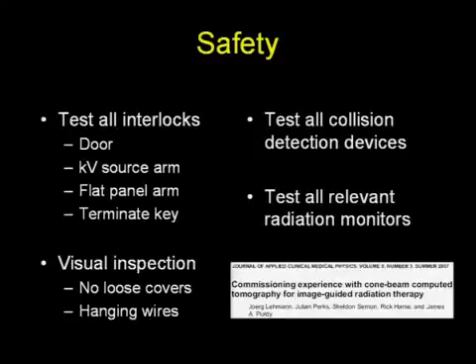So this is the header of a paper that was published in JACMP from Jörg Lehmann that outlines nicely the safety features that people should consider when implementing a new IGRT device.